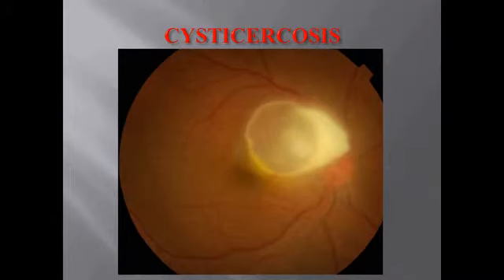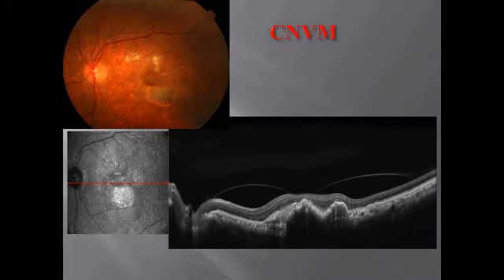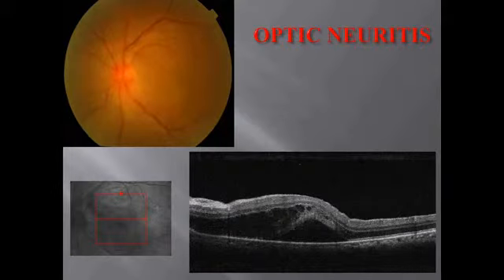This is cysticercosis. We find it once in a while back home in India, and you see these worms coming up, and look at the way the vitreous interface is seen on top of the cysticercosis with that infiltration, which tells you that there is a localized inflammation coming on top of these areas. And these are choroiditis, where you also see the deeper choroidal areas which tend to be much more thickened. The larger vessels of the choroid tend to show much more thickness.